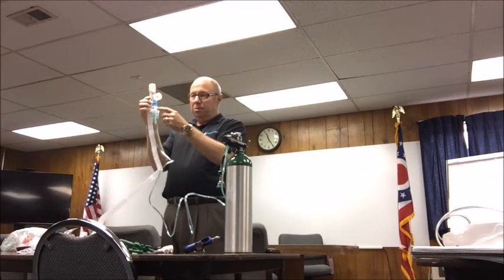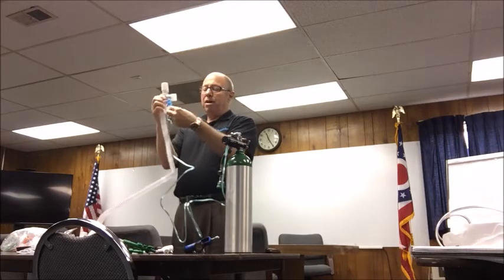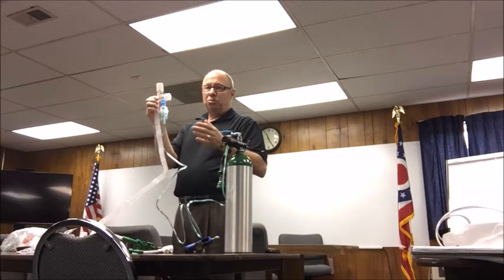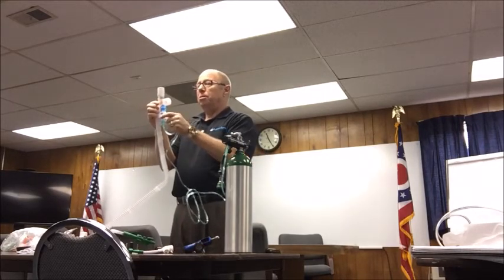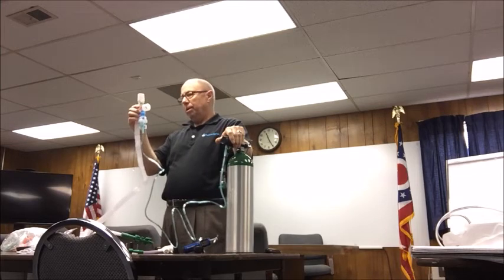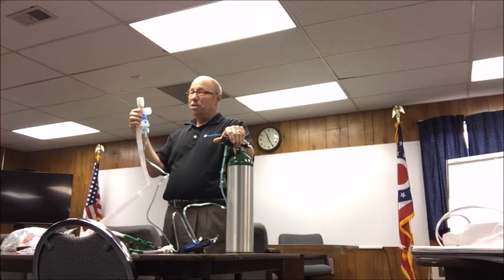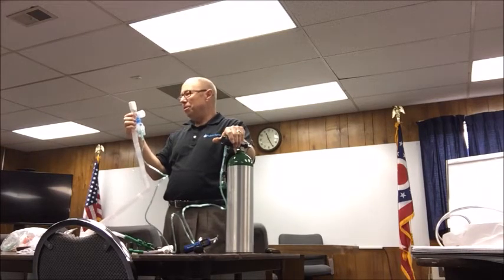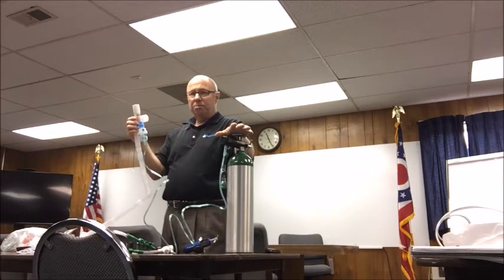Now, this nebulizer has a needleless port. So if I want to give a second treatment, I can take my albuterol pillow and I can stick it right through here and give a second treatment. That sounds real good in a hospital where they're not moving. But in the back of an ambulance, this is what's going to happen. All you have to do is kink the hose, pull this out, drop your medication in, put it back in. That's how simple it is. And now I'm nebulizing the patient. Nothing's changed. Any questions about that? I wish I could make this hard, but it's not real hard. Especially y'all that have been using CPAP, so you understand what's going on. Any questions before we move on to something else?